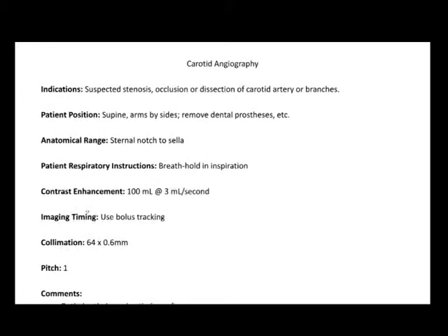The respiratory instructions is going to be breath hold and inspiration to keep this anatomy stationary as best we can, even though the heart has motion, and to some degree this will be obscured. The contrast enhancement is going to be 100 milliliters at 3 milliliters per second.